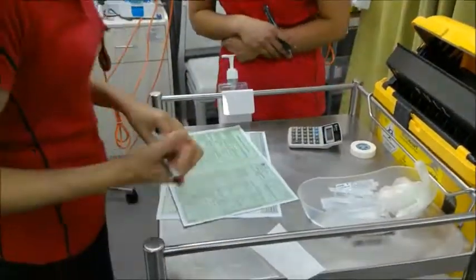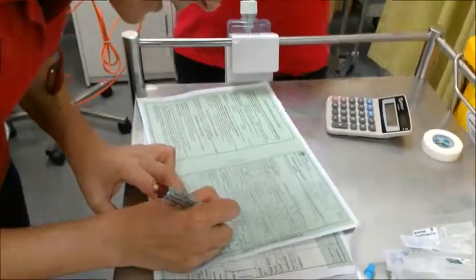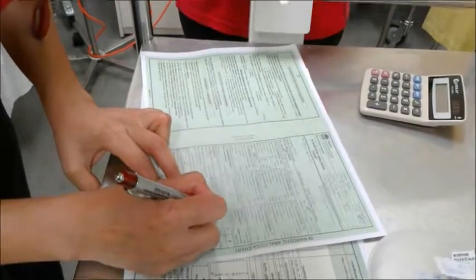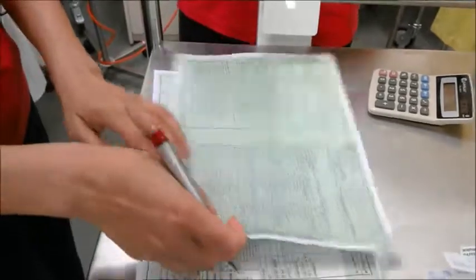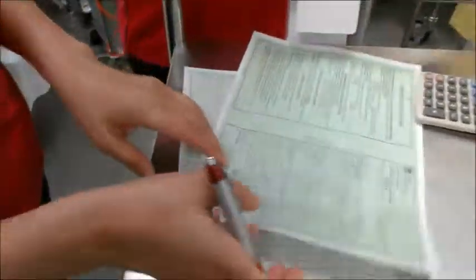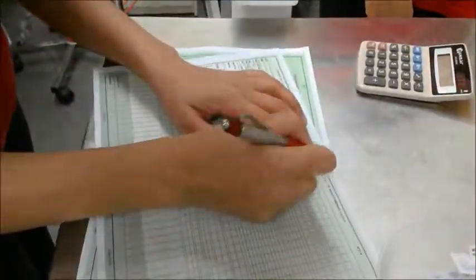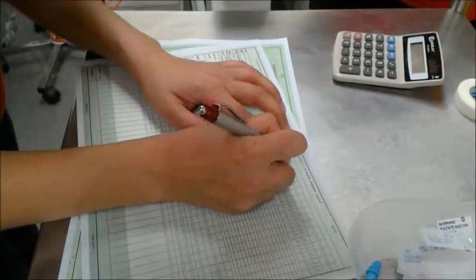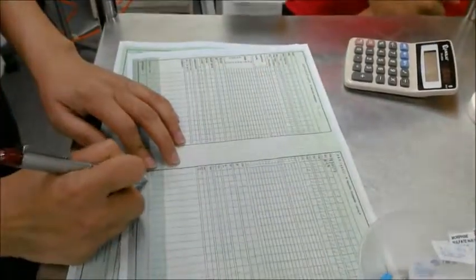Now I'm just going to sign my medication. That is 18 05 17 12 24. Would you mind to sign here for me, please? Yep. So I have started my patient on PCA, and I'll also do the initial set of observations. 18 05 17. So here's my signature. Would you mind to sign here for me, please?